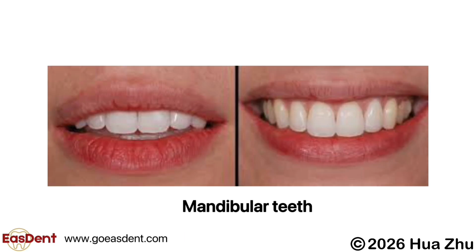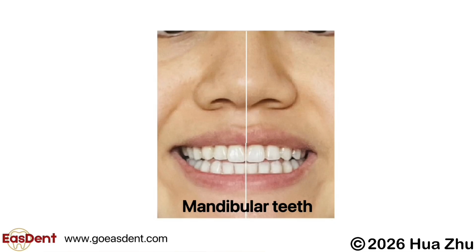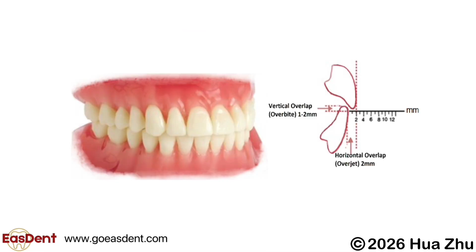At rest, the incisal edges of the mandibular incisors should be positioned at the level of the lower lip line or slightly above, symmetrically aligned with the lower lip and following its natural curvature. The midlines of the upper and lower teeth should align with the center of the face. The mandibular occlusal plane should correspond to the corners of the mouth. If the mandibular teeth are not in ideal position, as long as you can provide correct centric relation and VDO and the good clinical pictures, the lab can set up the mandibular teeth correctly according to the ridge, retromolar pads, and maxillary teeth position.